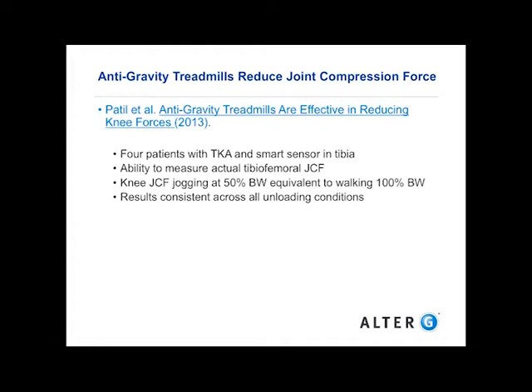So for patients that want to increase cardiovascular activity or want to return to running, if you've had a joint replacement, a lot of times it's not recommended. Well, in the anti-gravity treadmill, we know you're not going to be putting any more stress to those joints than you would be walking over ground.